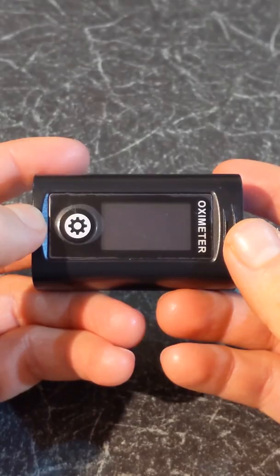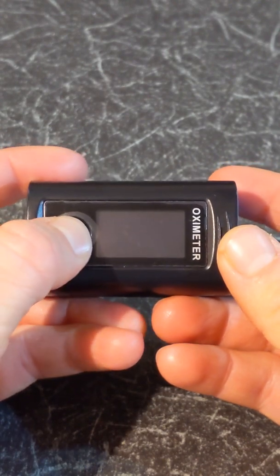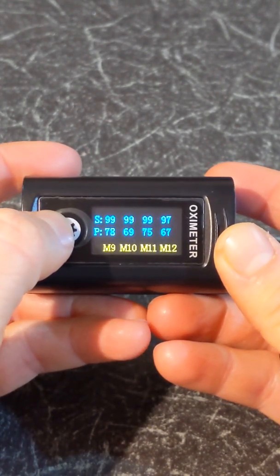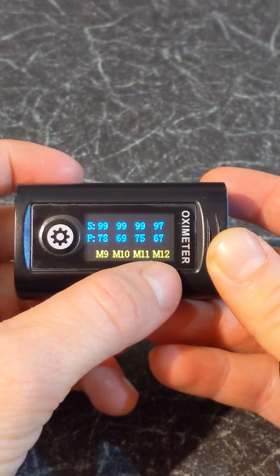While your finger is out, a short press on the wheel icon will display the history of your measurements. The newest record is marked as M1 and the oldest record is marked as M12. The new record will override the previous one.